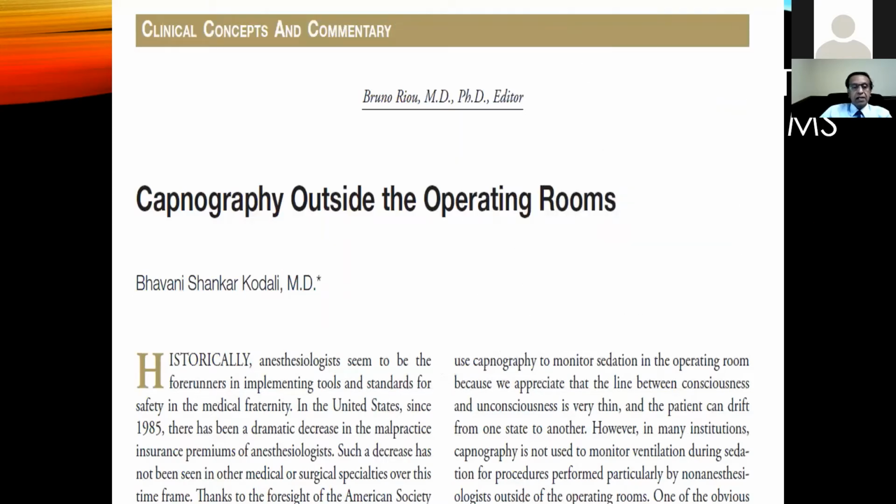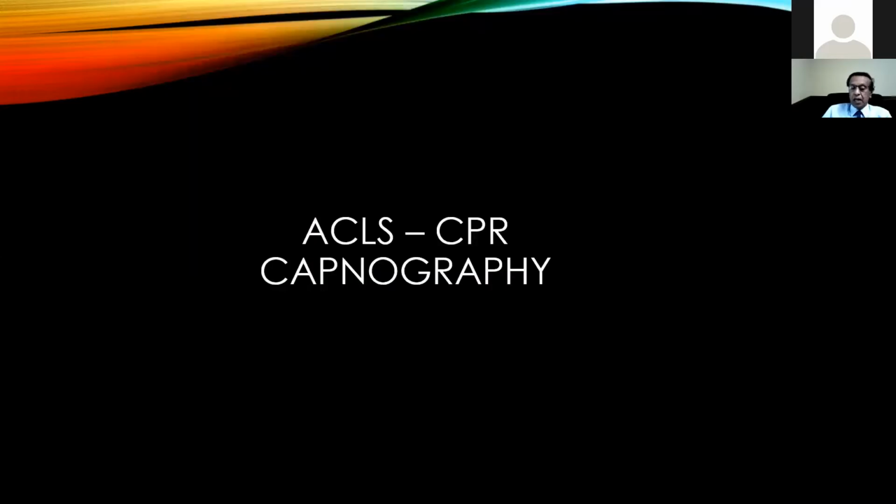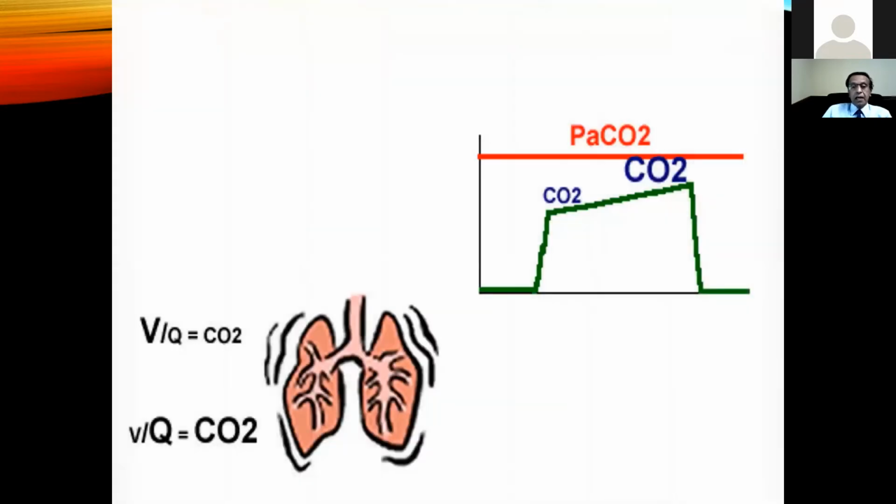Now, I did write an article on capnography outside the operating rooms for the journal Anesthesiology, and this is a free download. I encourage all of you to read this article. Now, if you look at the ACLS algorithm for CPR, capnography has been strongly recommended and introduced into the current ACLS guidelines.